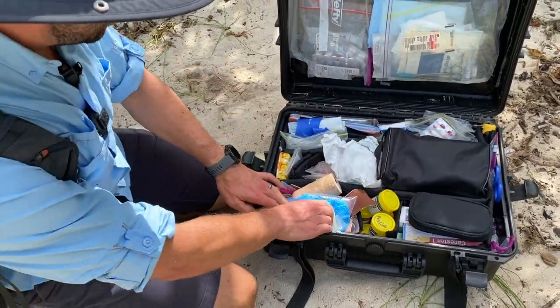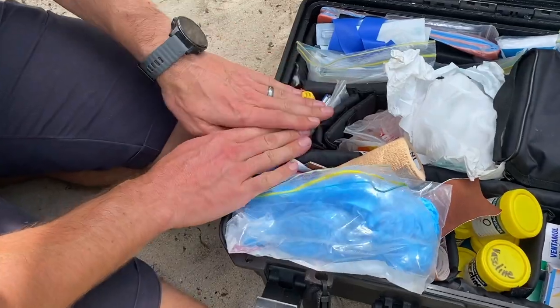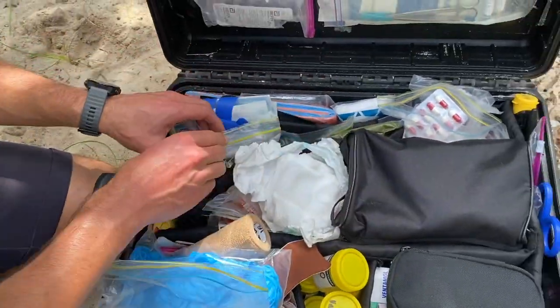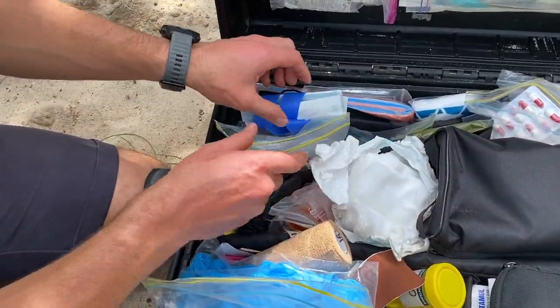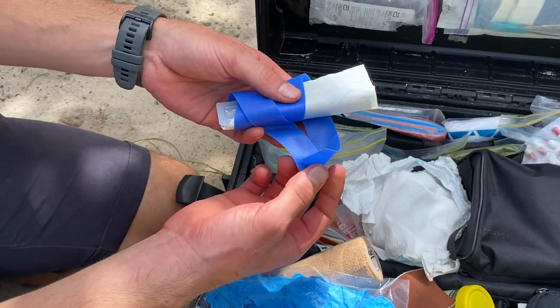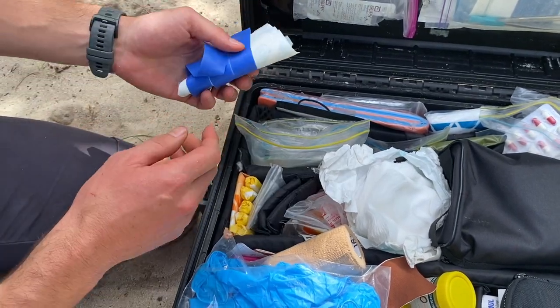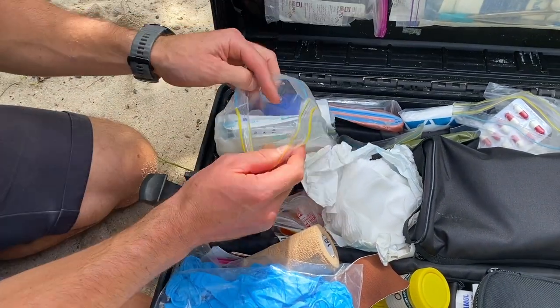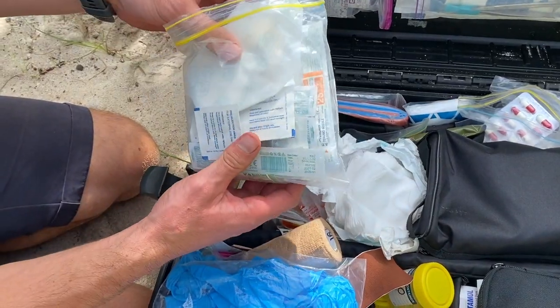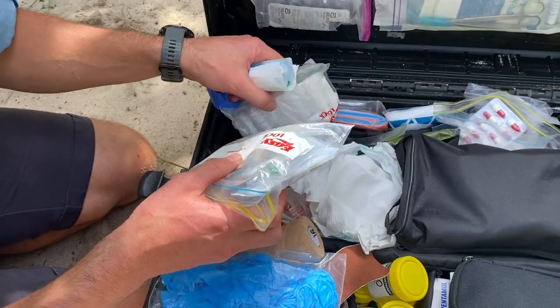In this little pocket here I've got some sanitary products — some sanitary towels and some tampons. Moving up here, this is all the IV stuff. I've got a cannulation kit all ready to go: a tourniquet, a cannula, Tegaderm, and gauze in there for quick access. In here there's more IV stuff — some needles and different sized syringes.